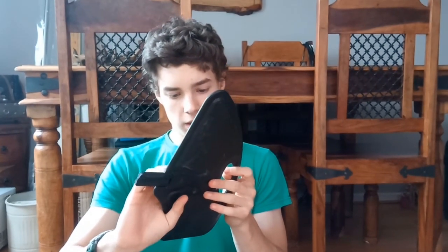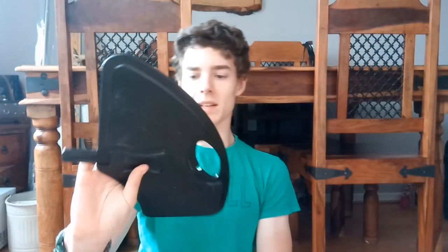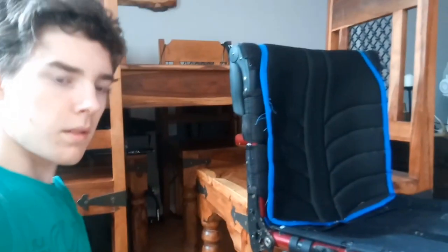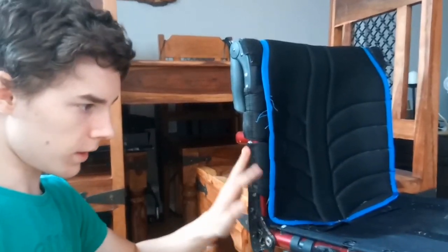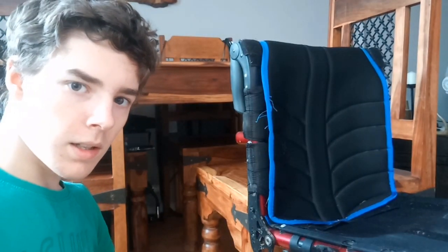Now, one thing I have noticed is there's a little scuff mark, which is where it's pressed against my wheel from being stuck in the thing. I'll show you guys what I mean a bit more later when I reassemble it. But now we've done them, they're not perfect, but who cares? So I have just propped it up on a chair, as you can see. And what I'm going to do now is just clean off this bit and around here. You know, it's not looking the best.